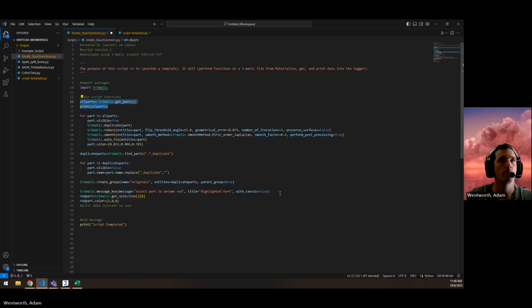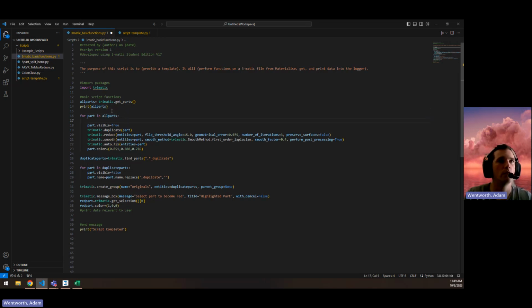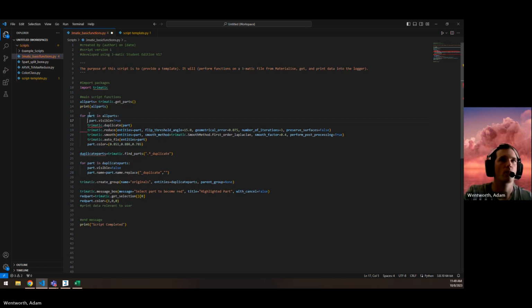The next thing we need to do is, if we're doing some functions on a list of parts, we need to do a for loop. The for loop will say for whatever piece, this could be any word, we just write part because it makes sense, for that item in the list of all parts, and then write a colon, and then when you hit enter, it will indent one line. Then you can write whatever functions you want to happen to that index value. So it starts on the first item in the list, does everything in the loop, and then goes to the second item in the list and does everything in the loop, etc.